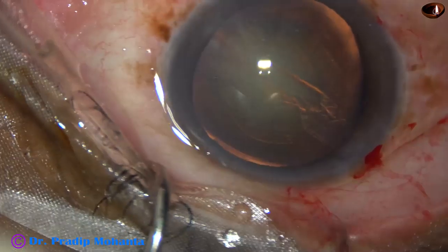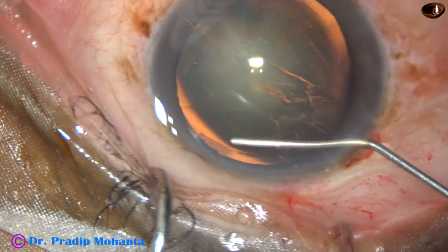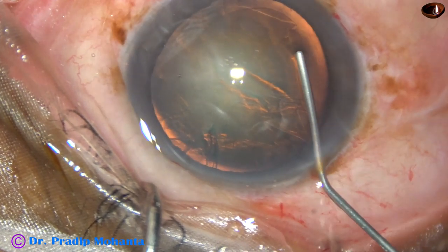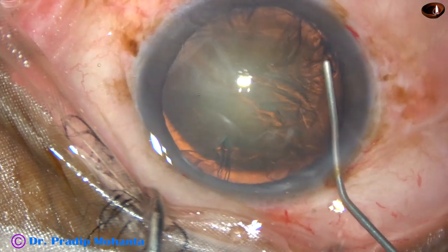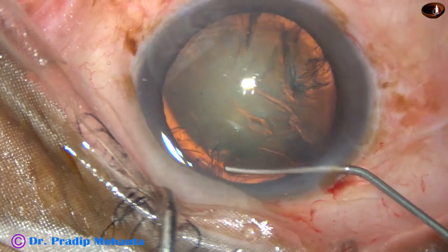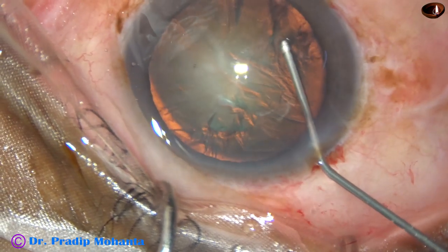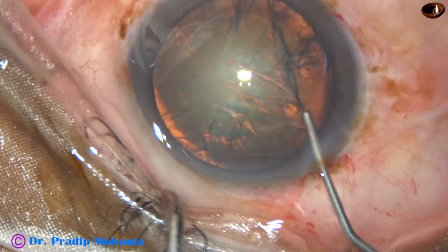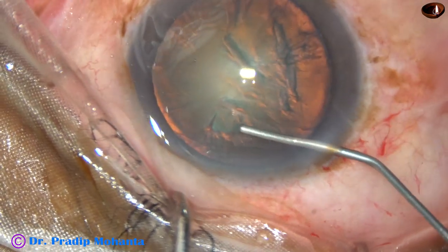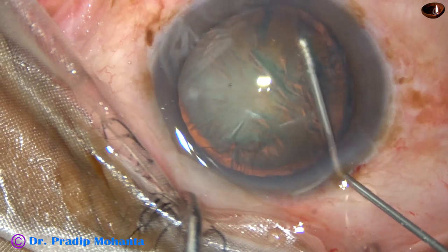Now, hydrodissection. My plan is to do hydrodissection but not rotate the nucleus at this moment. I want to rotate the nucleus after placing a CTR — a capsular tension ring — after a thorough hydrodissection. I am injecting BSS at multiple points to be sure that hydrodissection has occurred nicely, because if the hydro is good, application of a capsular tension ring will be easier.